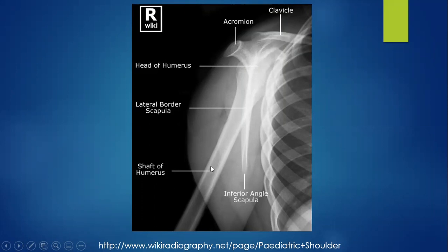They kind of moved the humerus a little bit out of the body. It should be lying straight over the scapula. This is off of Wiki Radiography. Usually they are good x-rays, but this one looks more like it's not for the shoulder, but for a scapula picture. So I think we might need to fix that. We'll look at it in our book and talk about it more.